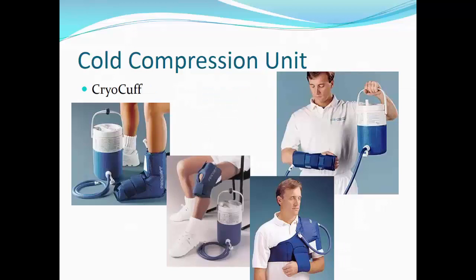The CryoCuff is a low-tech version of the cold compression unit. This unit costs approximately $125 to $150. The way the CryoCuff works is by placing 4 liters of ice and water within the thermos. The thermos is then elevated and the cooler fills and pressurizes the cuff. The compression is controlled by gravity and is proportional to the elevation of the cooler.